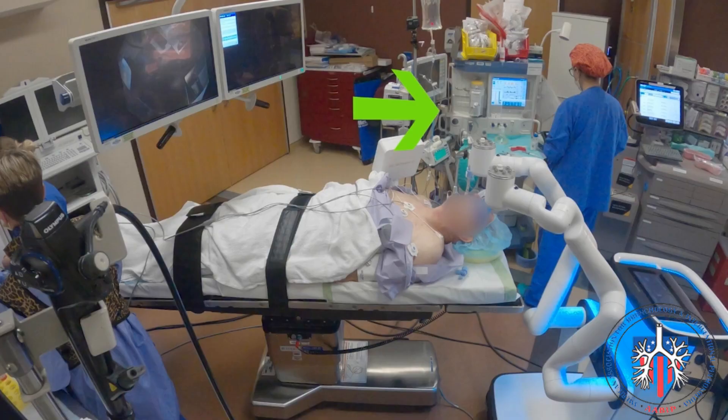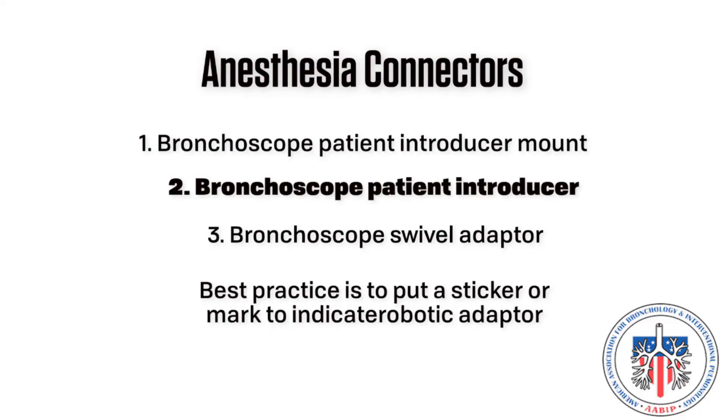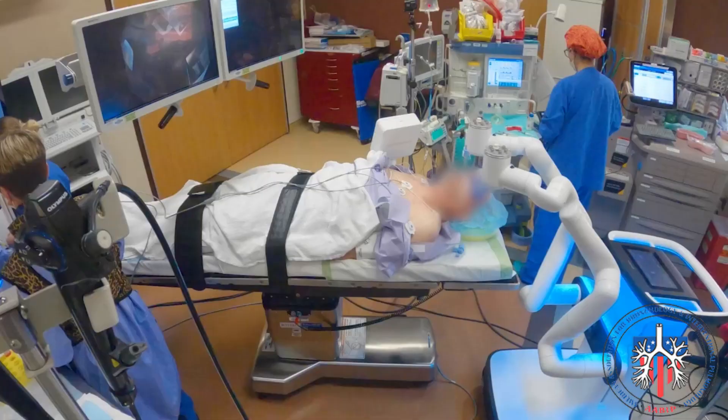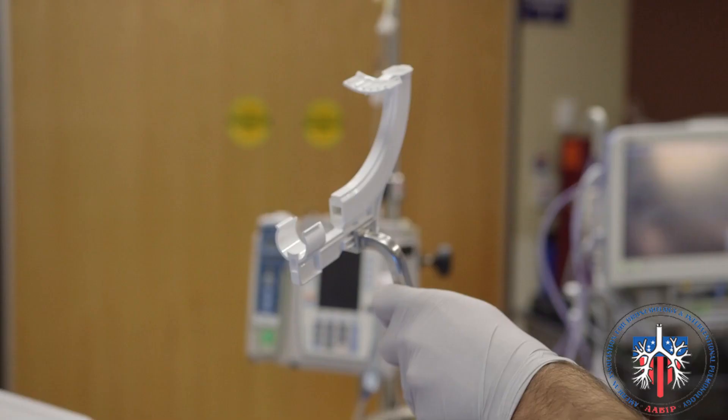Anesthesia connectors. The anesthesia connectors will allow a patient to receive ventilation from the anesthesia machine while offering a stable platform for robotic bronchoscope insertion. Number one: the bronchoscope patient introducer mount. This will hold the bronchoscope patient introducer and will be positioned on the same side as the anesthesia machine and positioned at the level of the patient's lips, opposite the Monarch cart. Number two: the bronchoscope patient introducer. This white plastic connector will guide the robotic bronchoscope into the endotracheal tube and will be connected to the patient introducer mount.